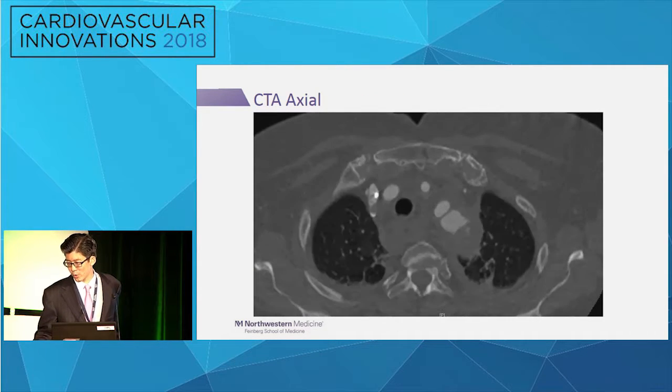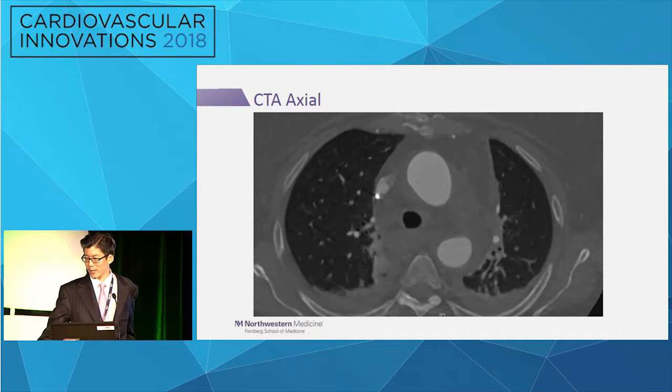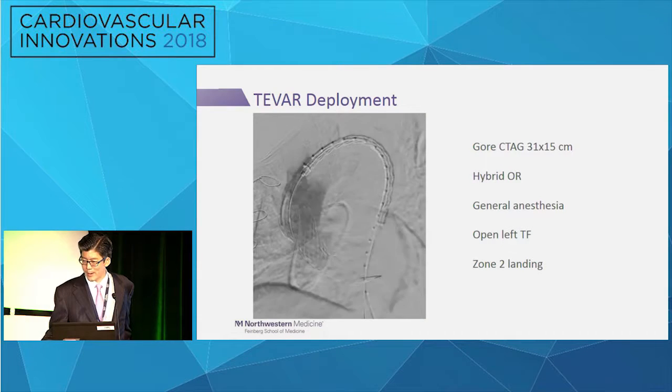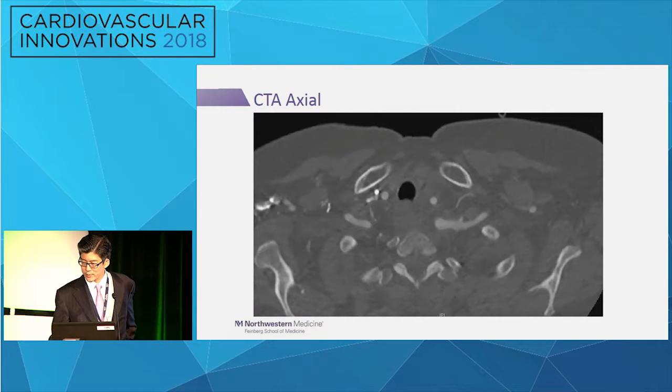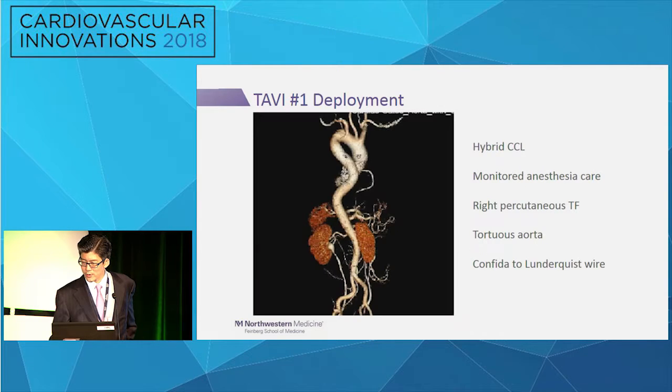We pull her off the fluoro scan and take her down to CT, and of course, there's an aortic dissection here with a contained rupture. So we take her back. This time, general anesthesia, hybrid OR. Where do you think the rupture was? Where does that play on your aortography? Because I don't see it on the aortography. I don't see it on the aortography either, but I think it's as we're pushing the catheter around the descending aorta. So you got that S-turn. It's happened at that S-turn just distal to the left subclavian artery.